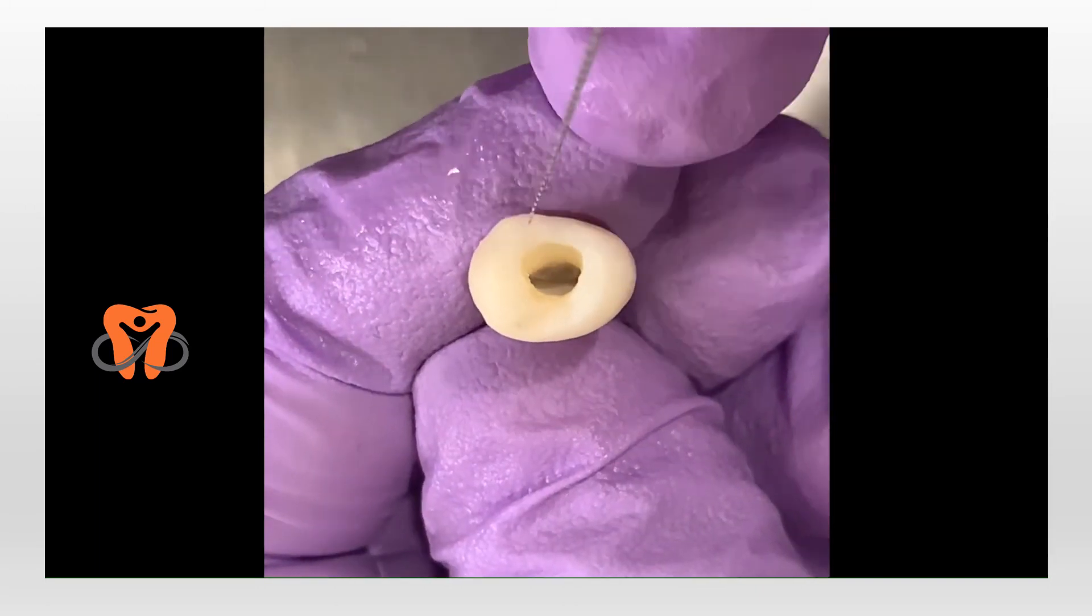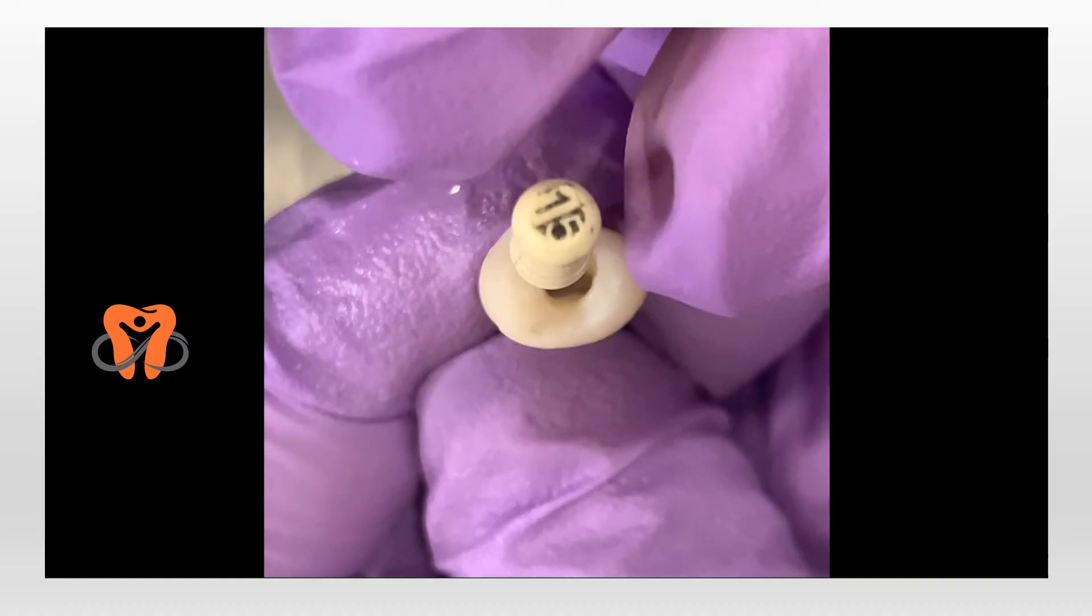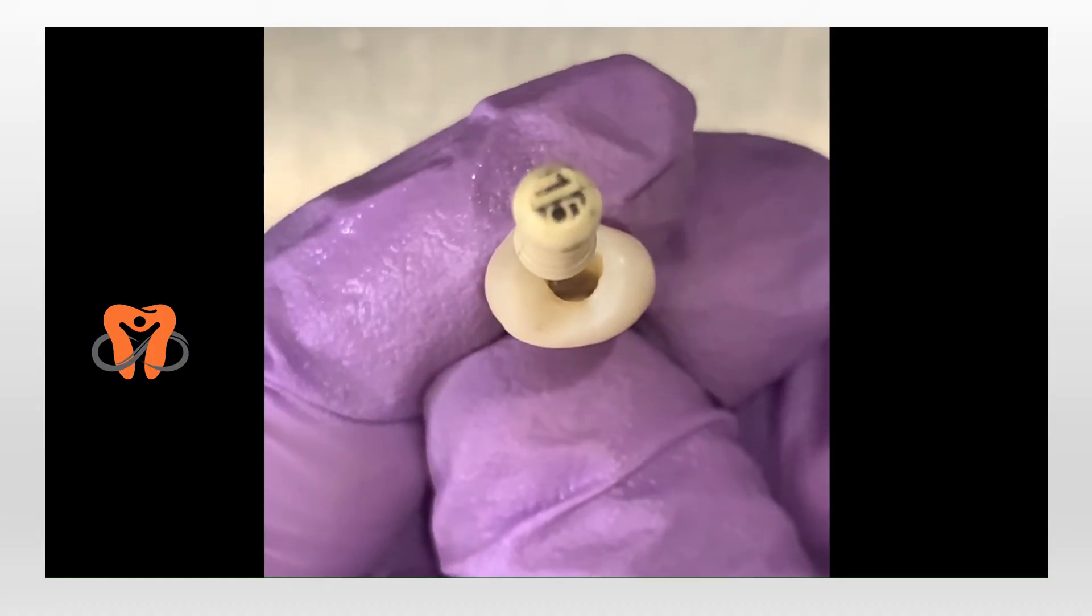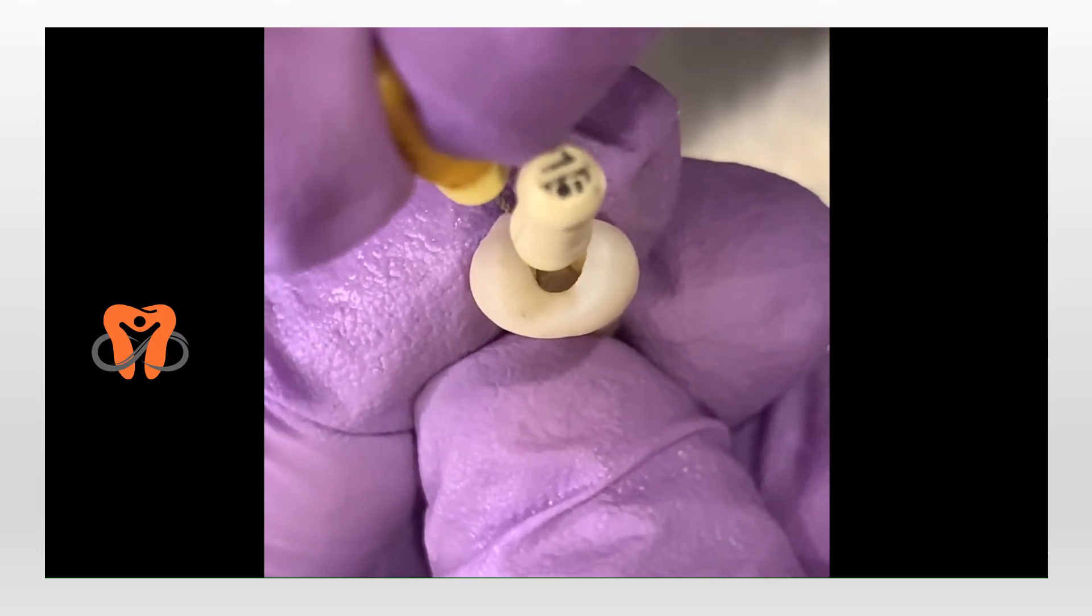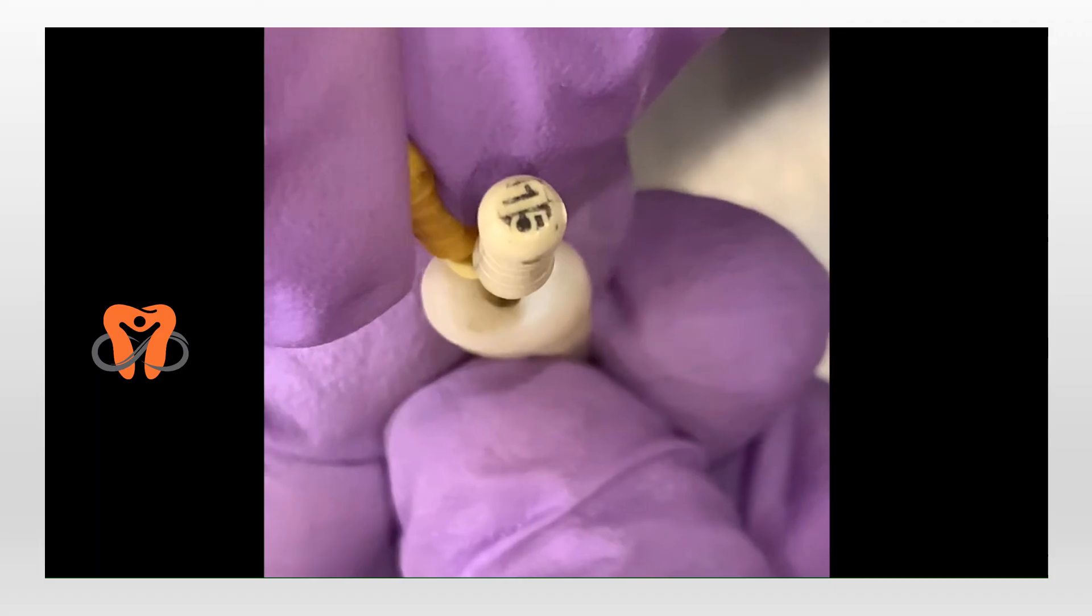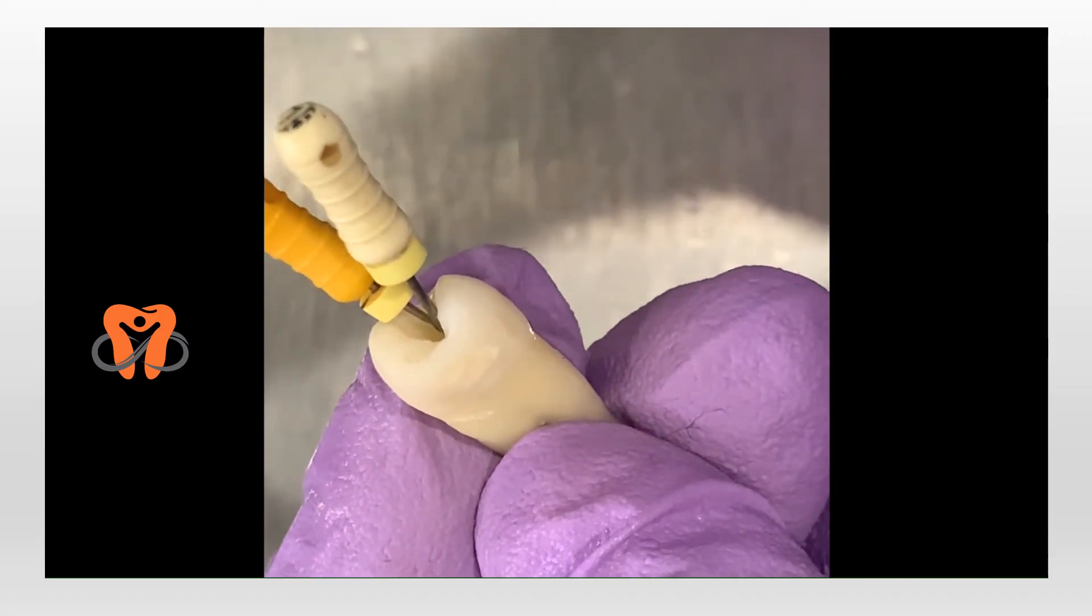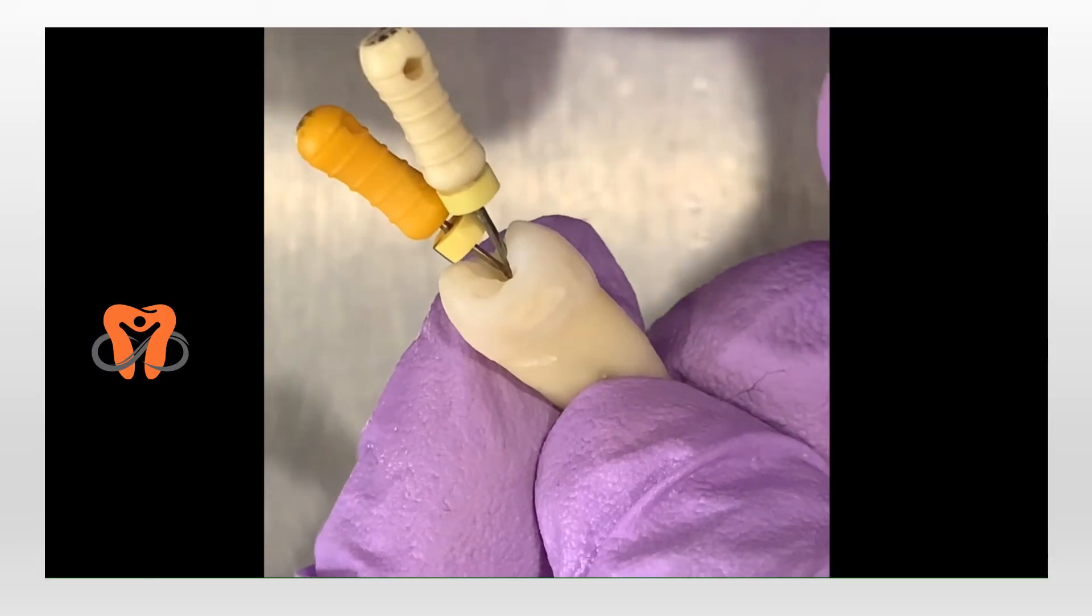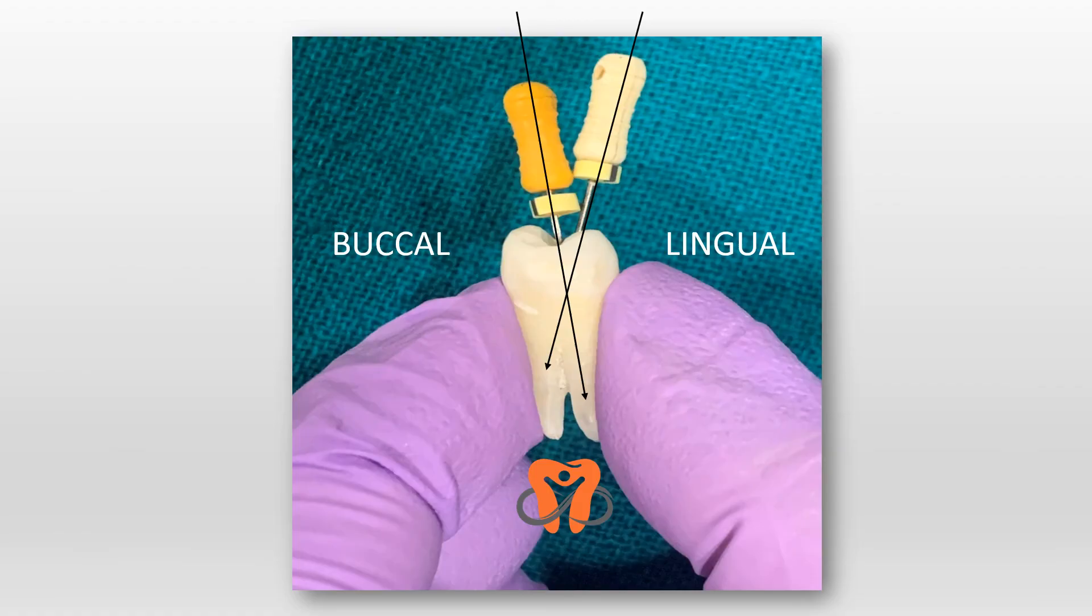I take a 15 number file, and from the lingual direction I'll enter into the buccal canal achieving a straight line access. Similarly, taking a 20 number file from the buccal direction, I will enter into the lingual canal. So I've managed to achieve a straight line access for both buccal and lingual canals.